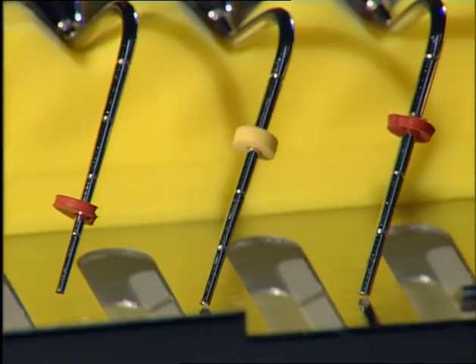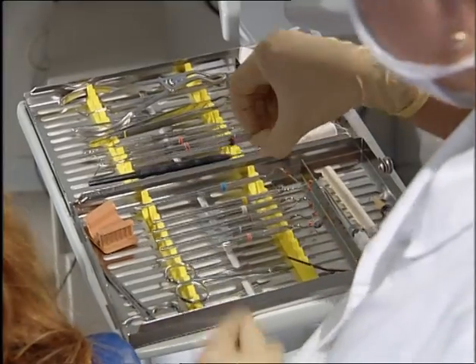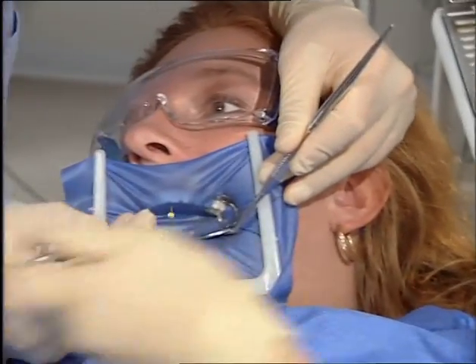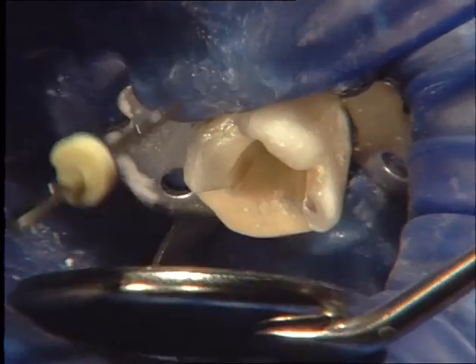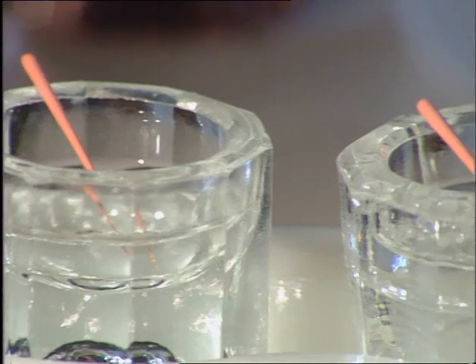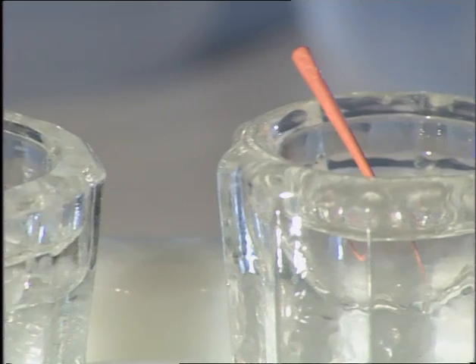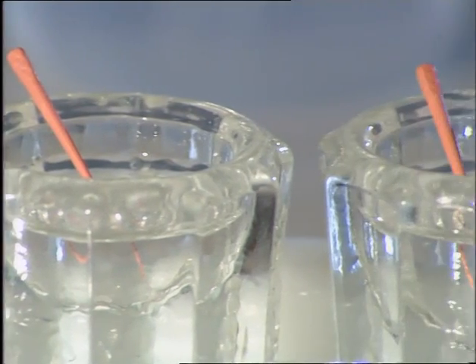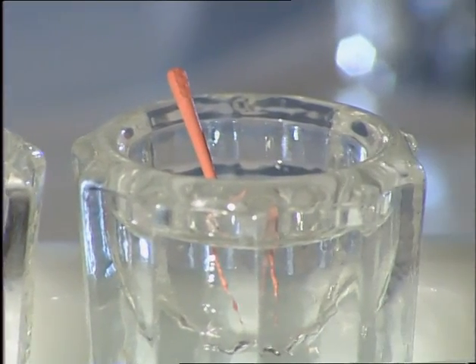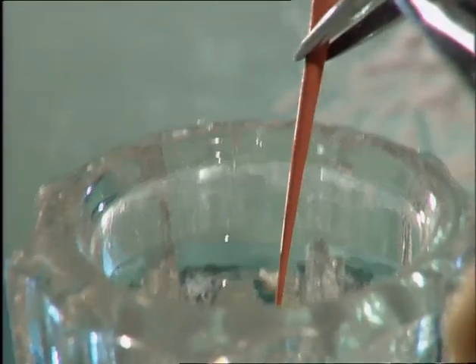Pluggers are selected whose diameter is just slightly less than that of the canal at any given level. Three pluggers are used for any one root canal preparation. They are pre-fitted to the desired length. The largest diameter plugger must work passively, unimpeded by dentinal walls, over a range of a few millimeters in the coronal third. A smaller diameter plugger is chosen that can work effectively in the middle third, and the smallest plugger is selected that can work easily to within 5 to 7 millimeters from the canal terminus.